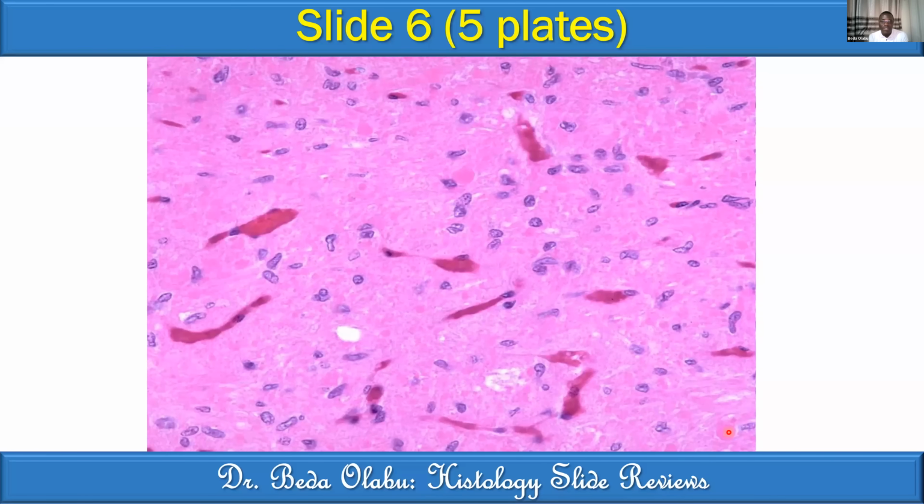The Herring bodies are the storage form for the secretions of the neurohypophysis. So these are storage forms. Those are at the end of the axons of the neurons which come from the hypothalamus to enter the pituitary. Their axons contain those secretions which are awaiting release. Herring bodies. So capture those three for neurohypophysis. Remember, it is predominantly fibrous.